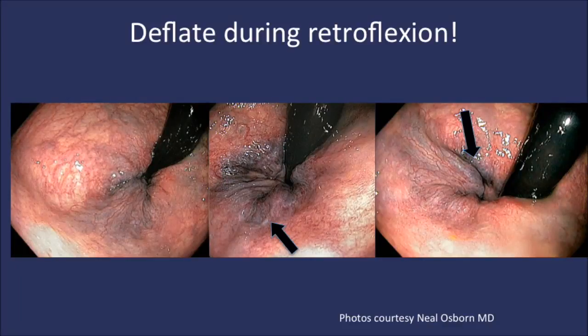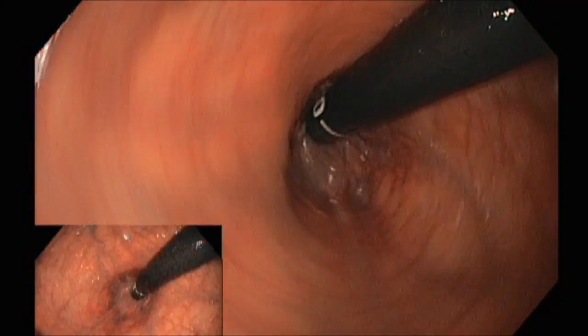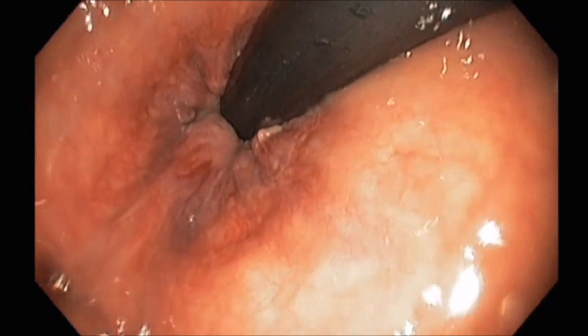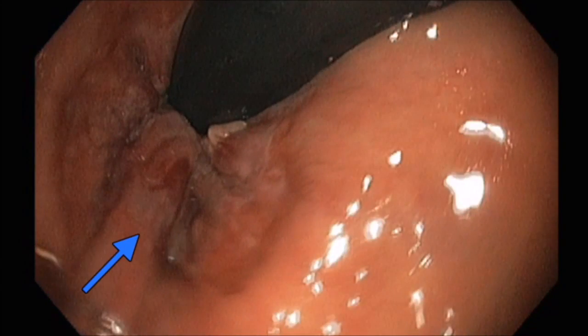The dentate line with the internal hemorrhoids being more proximal. In this clip you can see that the hemorrhoids become more prominent as you suction. The blue arrow points to the dentate line. As you suction air from the rectum, you are able to see more clearly the internal and external hemorrhoids, with the arrow pointing to the dentate line.